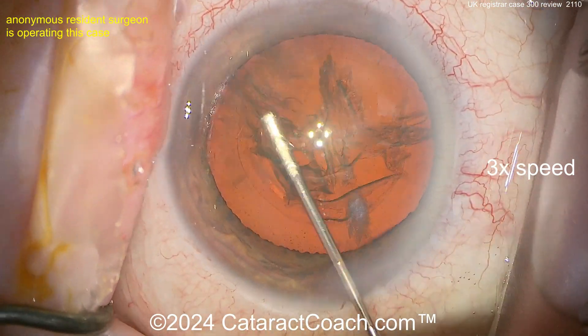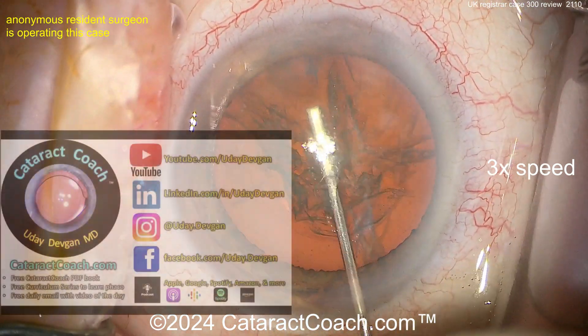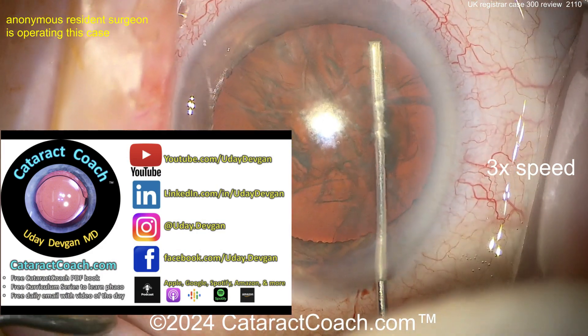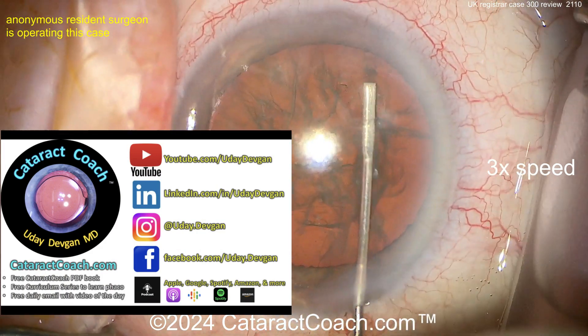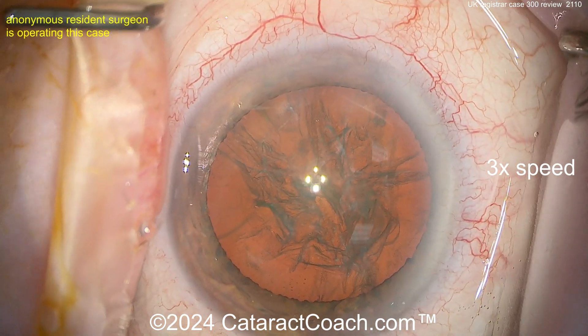It looks like a flattened cannula getting some good hydrodissection all around. By the way, do you know we have a full CataractCoach curriculum series? Go to cataractcoach.com and download the free PDF book — lots of good stuff for young doctors.